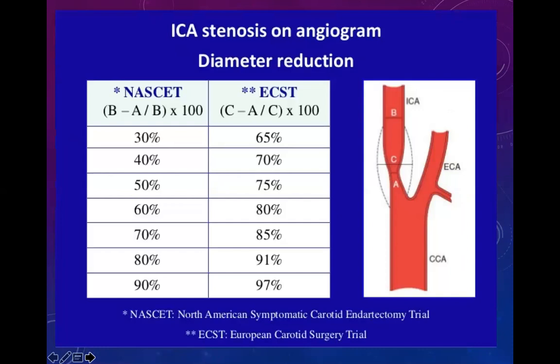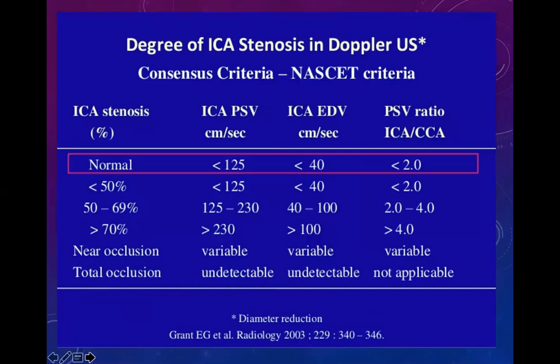I have seen your ultrasound scanner of the carotid, and I say, okay, where is this? Where is my systolic velocity? What's the ratio? You just show me a picture, and it says velocity of 300. I said, where is the end-diastolic velocity? Where is the ratio? That's incomplete information you're getting.